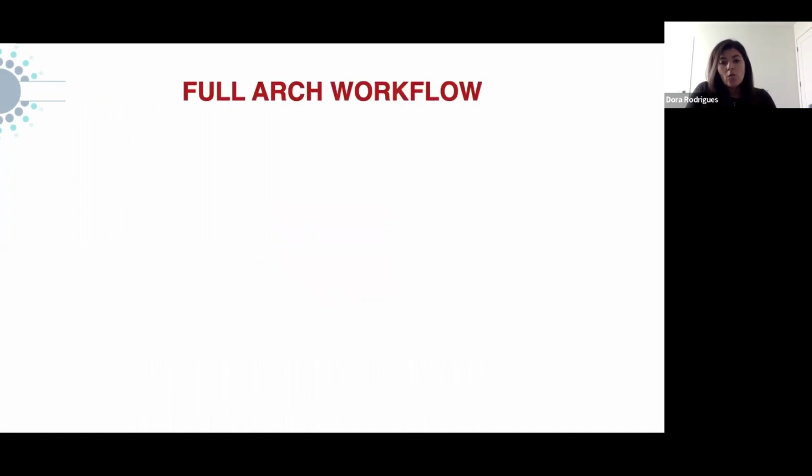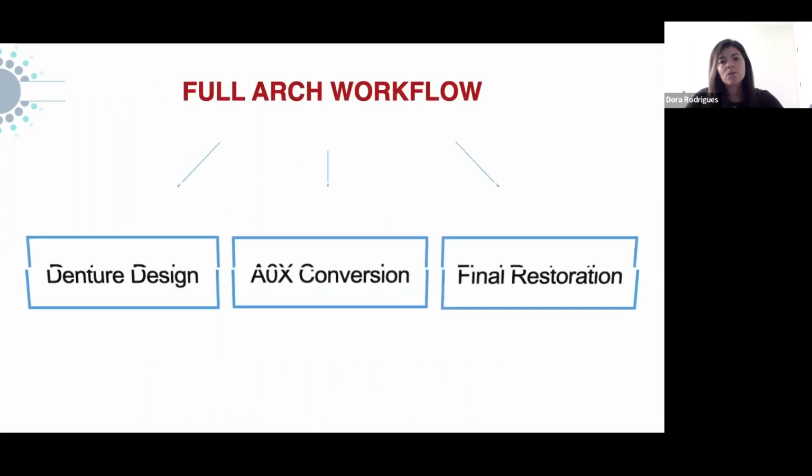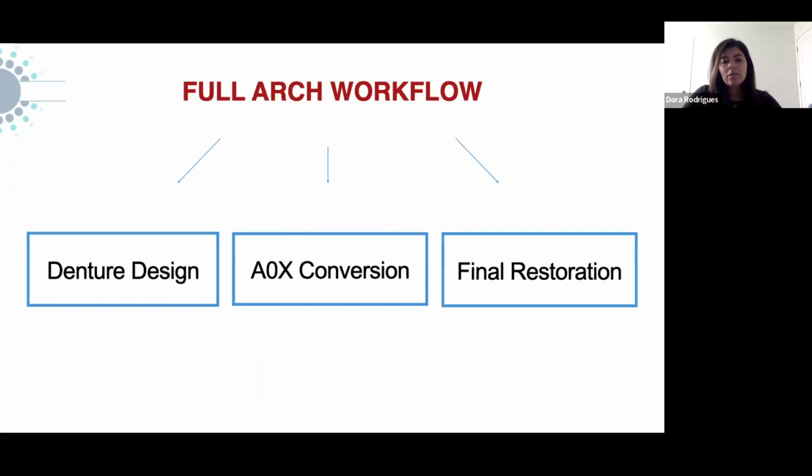And because we are doing the immediate load the same day, we are actually helping the osseous integration of those implants. So for the full arch workflow, I tend to divide it in different stages. The first one will be the denture design. Then is the actual conversion that happens at the end of the surgery, and then the final restoration.